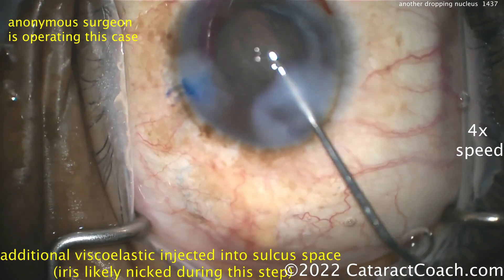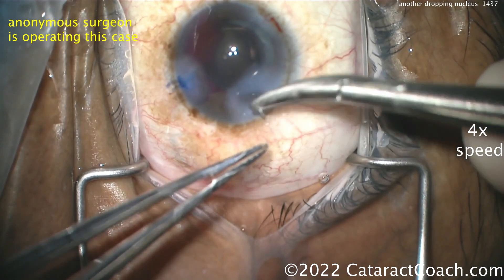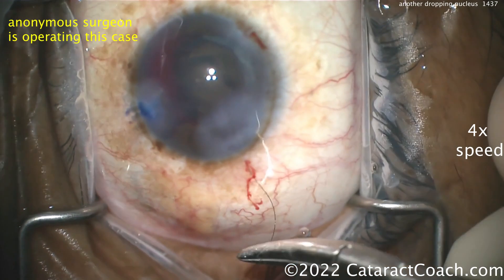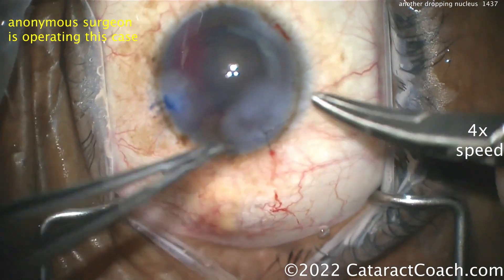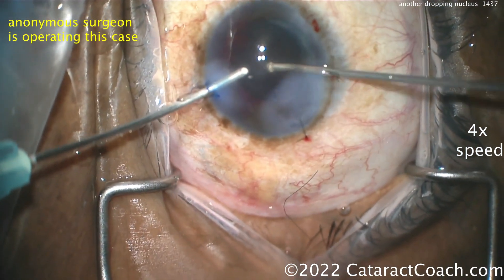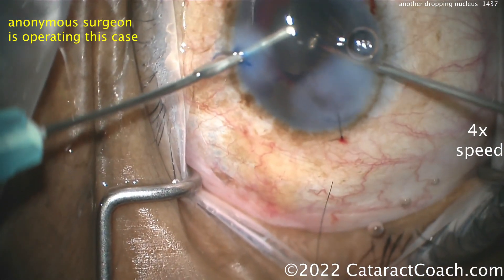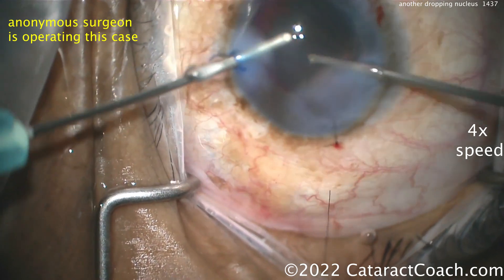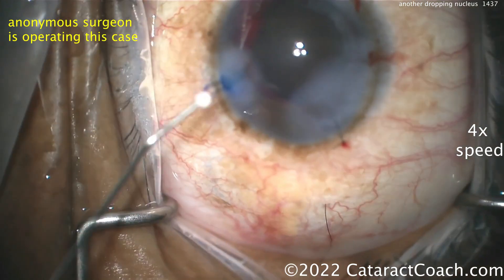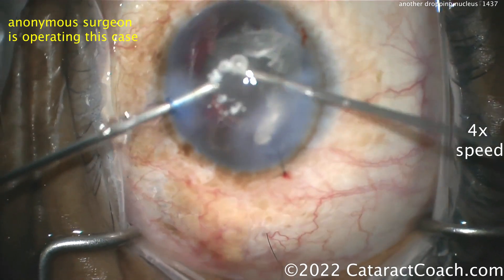There's the bleeding now. Getting the vitrectomy set up — close the main incision. Do not do a vitrectomy through the main incision; it leaks way too much. You need to do it as a bimanual approach with 23-gauge instruments through two separate incisions. You need to know the difference between I/A cut and anterior vitrectomy mode. To clean up all the prolapsed vitreous, set it to anterior vitrectomy mode. Position one on the foot pedal is irrigation, two is the vitrectomy cutter, and three is vacuum.